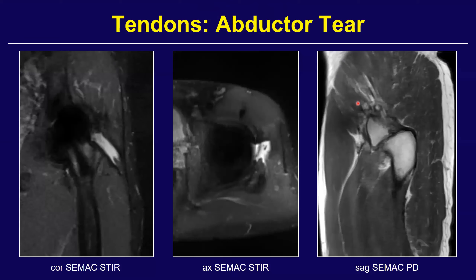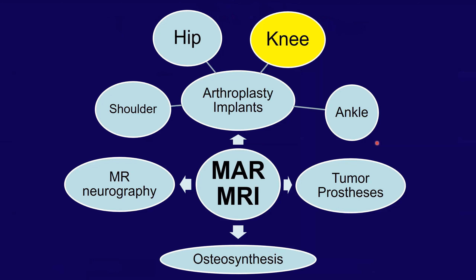Other advantages of MRI include evaluation of the abductor mechanism. Here's a hip resurfacing arthroplasty with a defect through the abductors, and on coronal and sagittal images we can show the size of these defects — which can sometimes be fixed arthroscopically.